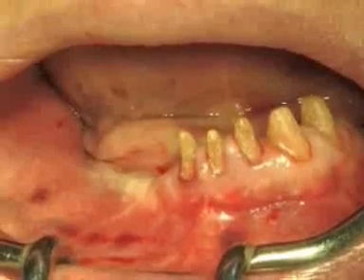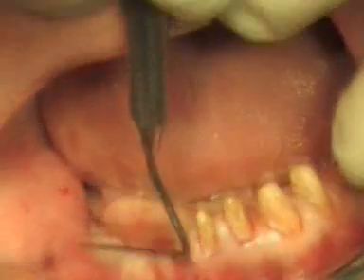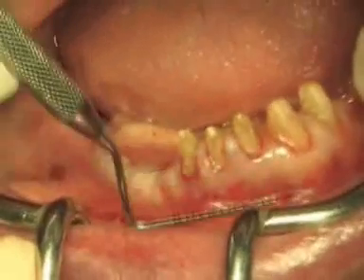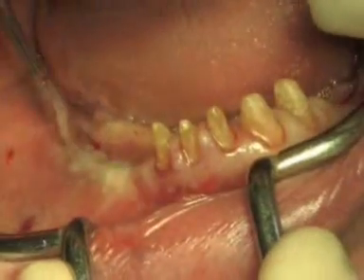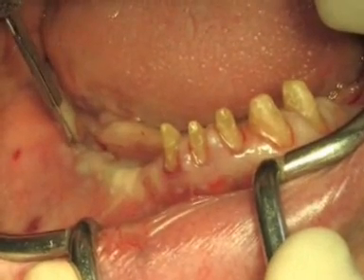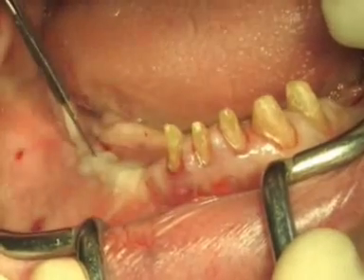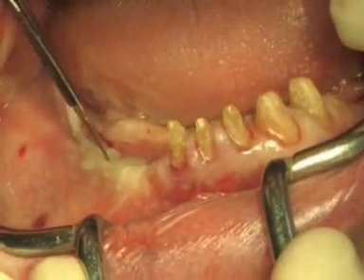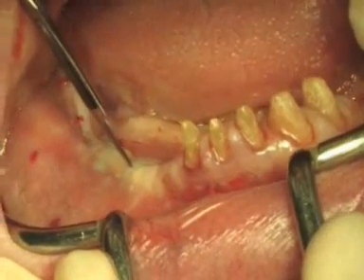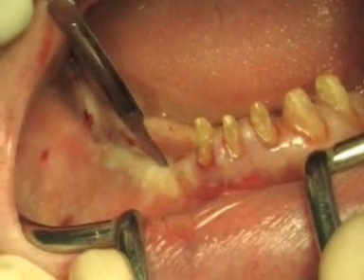Second stage surgery in implantology represents an unrepeatable moment for soft tissue management, which makes it possible to obtain a good aesthetical result. In this case, a big difference in level is evident on the vertical plane between the edentulous axis, where implants have been positioned, and the gingival margin of the remaining teeth. It is therefore important in this second stage surgery to compensate the different levels in such a way that both the implants and the natural teeth are on the same level.